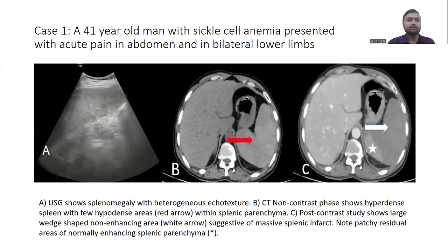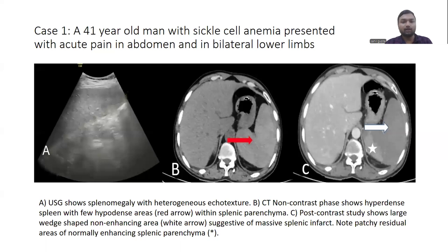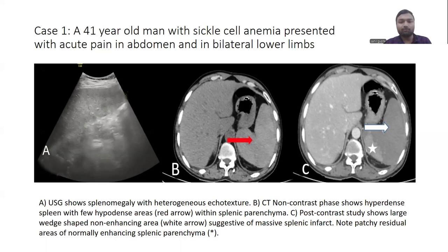Coming to the cases — first case: a 41-year-old man with known sickle cell anemia presented with acute pain in the abdomen and bilateral lower limbs. Ultrasound showed splenomegaly with heterogeneous echotexture. Non-contrast CT showed a hyperdense spleen with few hypodense areas within the splenic parenchyma. On contrast study, there was a large wedge-shaped non-enhancing area suggesting splenic infarct, with patchy residual areas of normally enhancing splenic parenchyma.